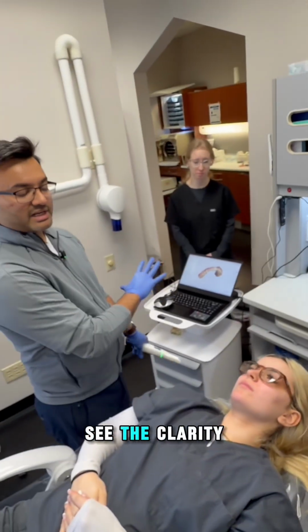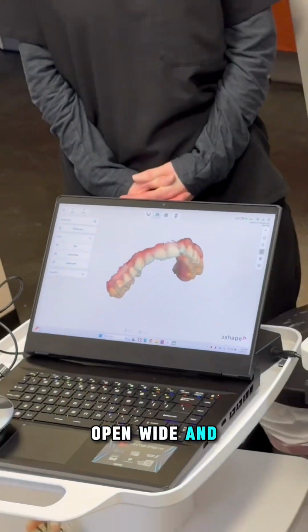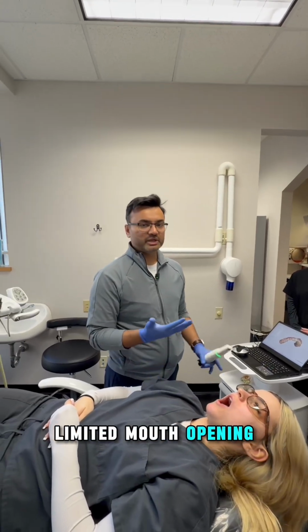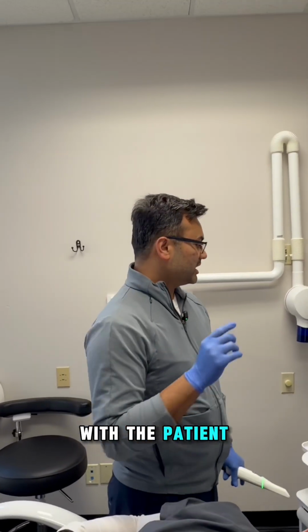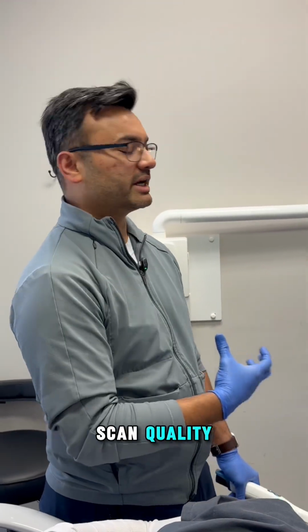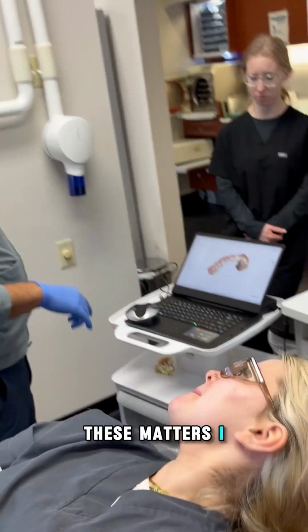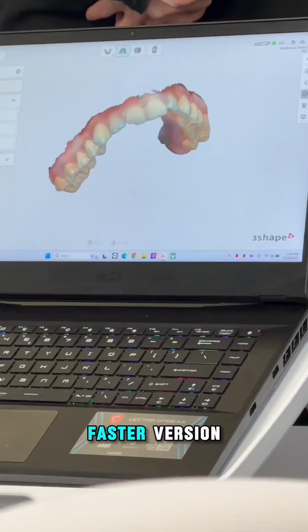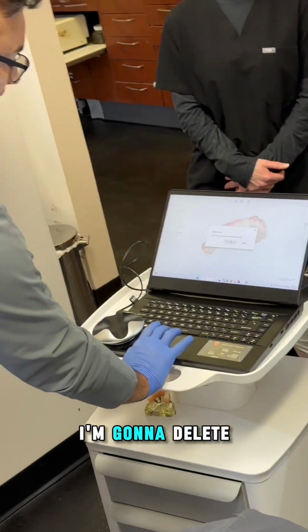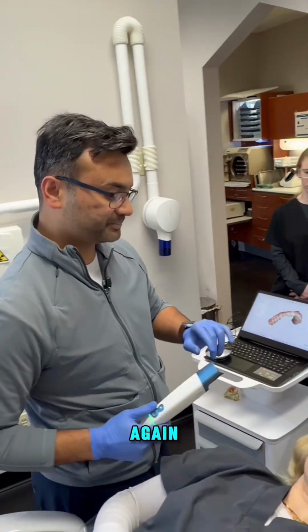So you can see the clarity of this scan, open wide, and I'm not even talking about a patient who has a very wide mouth opening. Limited mouth opening, normally what you see with the patient, these little changes in the way you scan, ergonomics makes a tremendous difference in your scan quality. These matter. I went pretty slow with it. If you really want to see a faster version of how this is really done, what I would do on a day-to-day basis, I'm going to delete this. We're going to start it all over again.